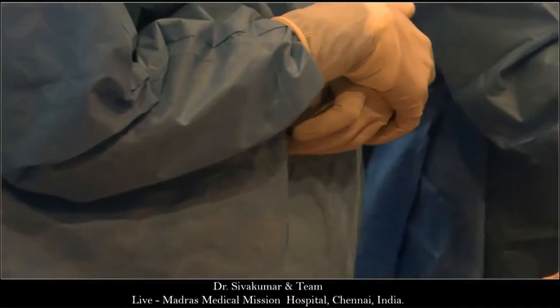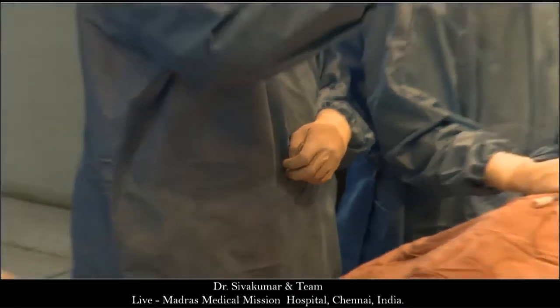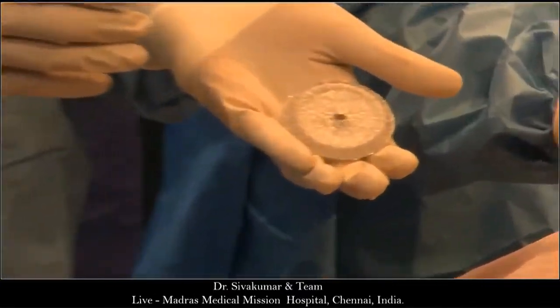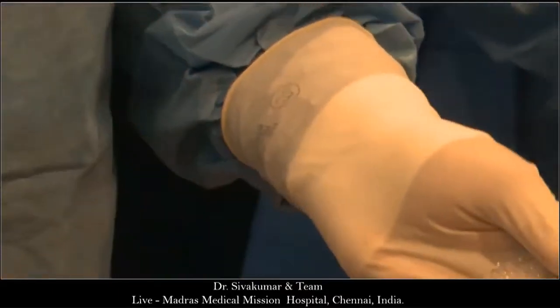Show the superior vein. Shiva, we're seeing your hands now. You're not doing anything naughty with your hands, are you? He's hiding a device. God knows what it was. He's decided on a device size.